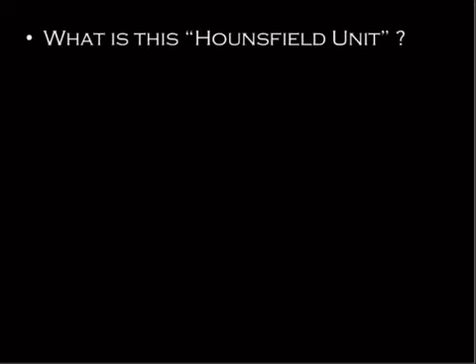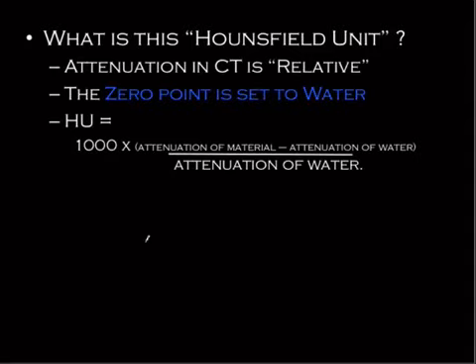So on CT, attenuation is all relative, and it's compared to water. It's one of the QA things that's done with the CT scanners. They have a tank of water, and they scan the tank of water, and then they zero, like you zero a scale. The actual formula for a Hounsfield unit is material minus water, divided by water, times 1,000. So the bottom line is, it's zero to water, and it's relative.